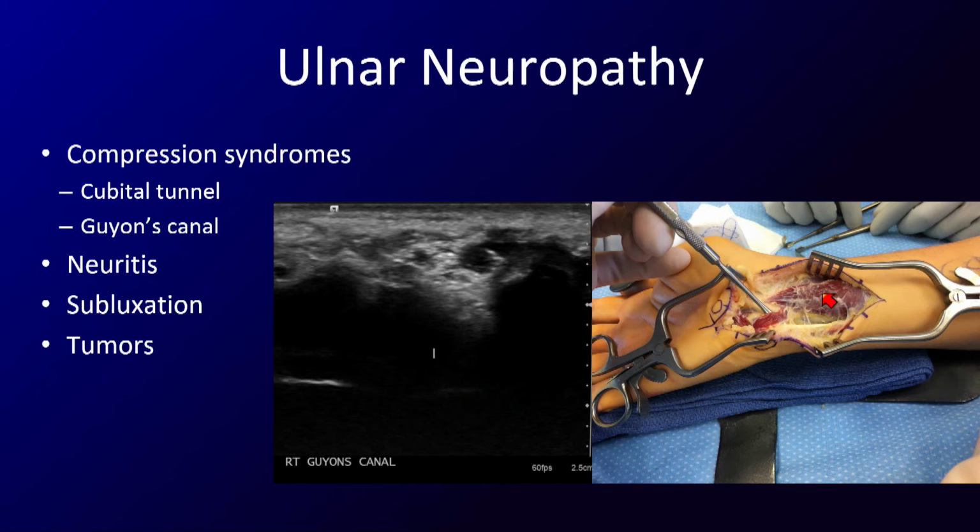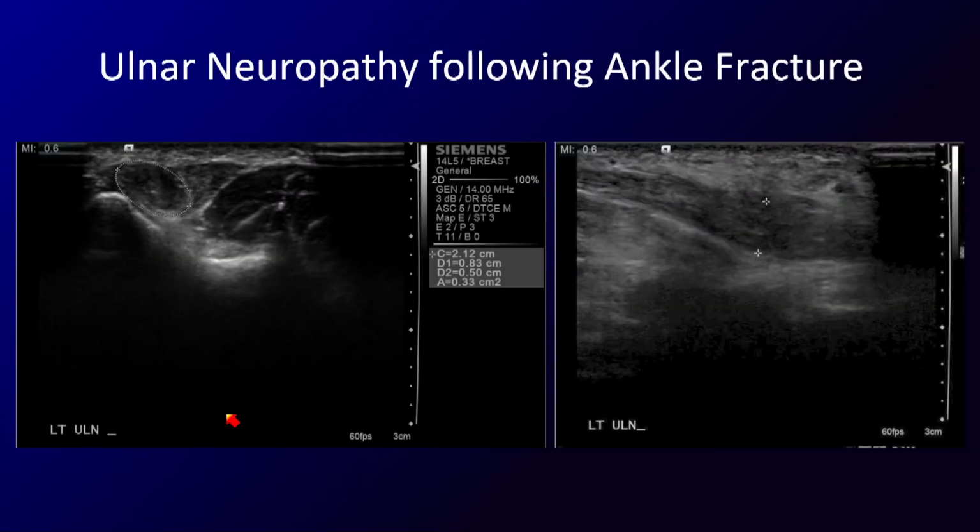And this is what it looked like here at surgery. So this was confirmed. But remember, common things being common, I scanned his entire ulnar nerve all the way up to the cubital tunnel, and his entrapment was actually at the level of the cubital tunnel. He's been living with this muscle all his life, and I told his surgeon, even if you remove that muscle, I saw the entrapment at the level of the cubital tunnel. So it might be something important to check when you're looking for nerve entrapment.